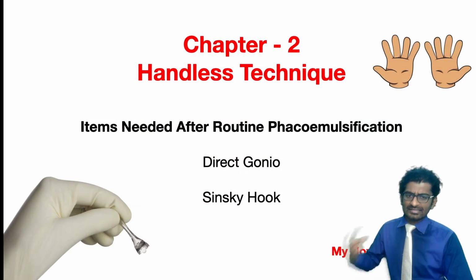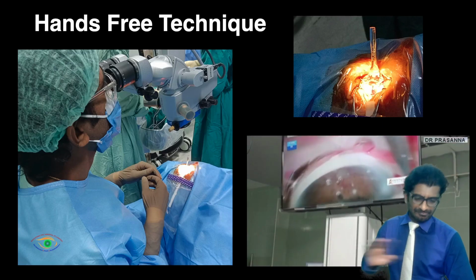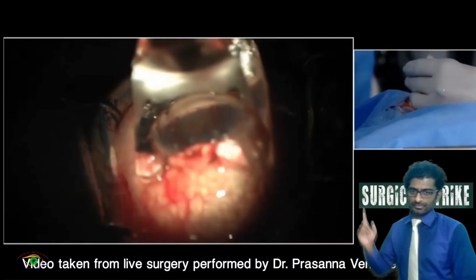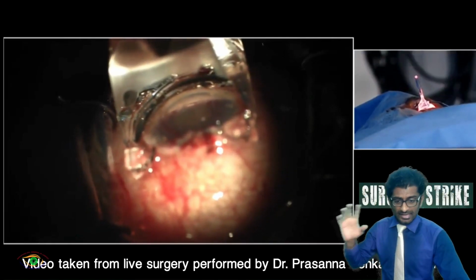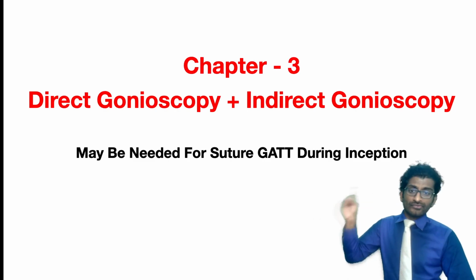Once you have practiced it, it's only a matter of time before you go for these hand-free techniques, which is very easy, my dear friends, once you have practiced the routine direct gonioscope. Again, this is one of my hand-free techniques that I perform in a live surgery. It's very much reproducible and you can really bank on it. And direct gonio with indirect gonio.